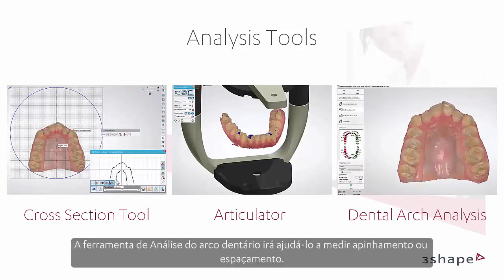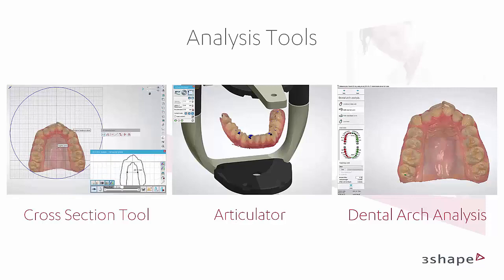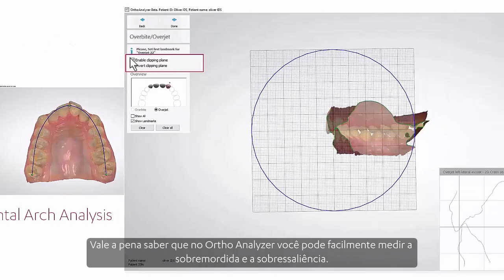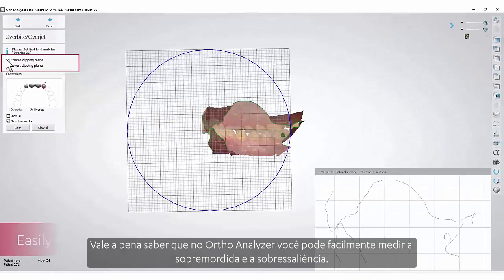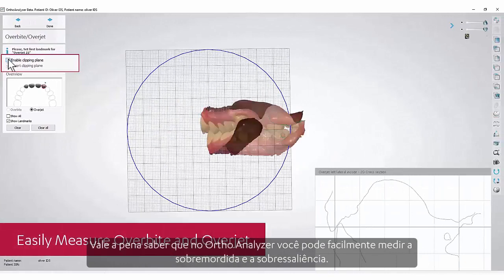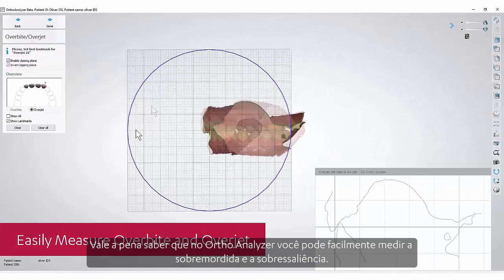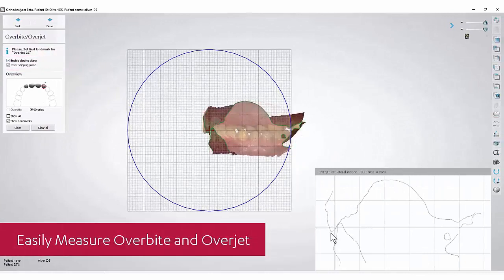The Dental Arch Analysis tool will help you measure crowding or spacing. It is worth knowing that in OrthoAnalyser, you can easily measure overjet and overbite.